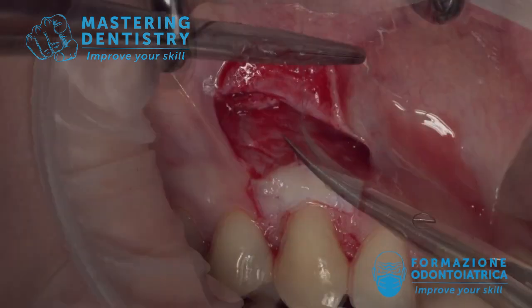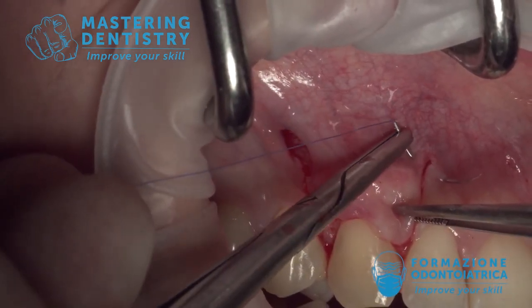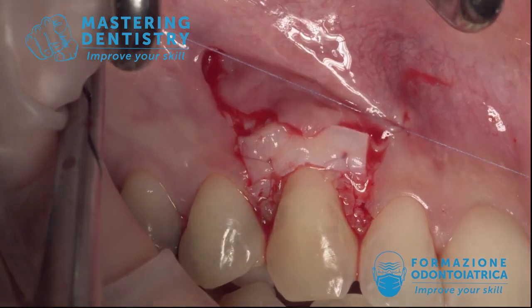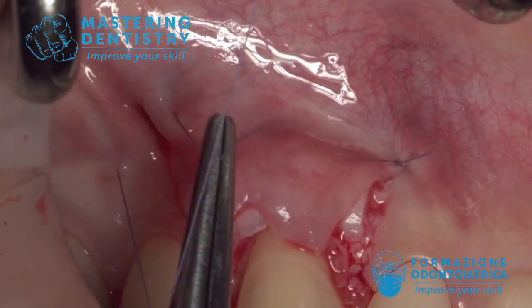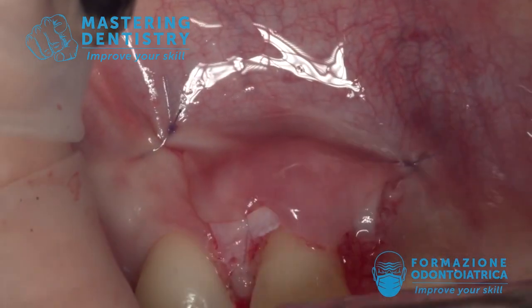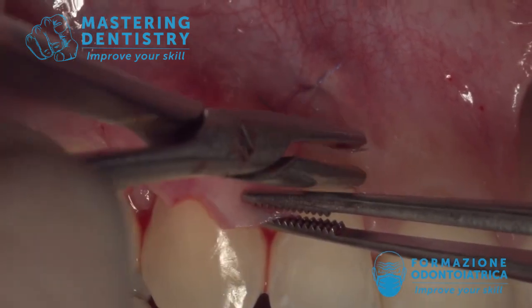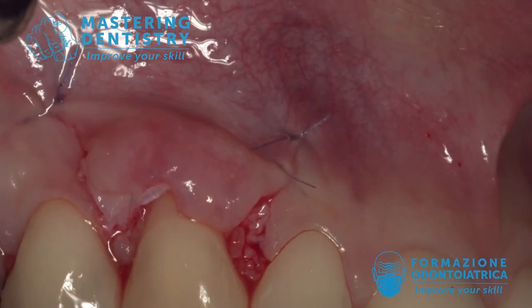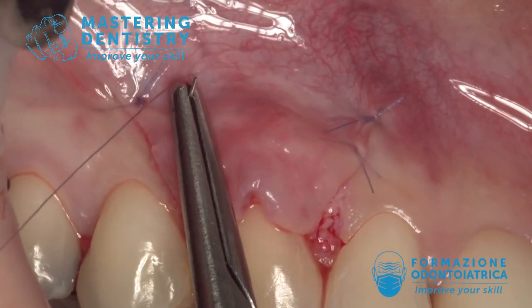The graft must also follow the shape of the new gingival margin of the flap. The first two sutures are apical, placed in the vertical incisions and anchored to the lateral periosteum, performed while holding the flap in its final position with the tweezers. You see, I hold the surgical papilla over the anatomical papilla and perform the suture. Once the first two sutures with 6-0 suture are done, you take the 7-0 suture and continue with simple interrupted sutures.